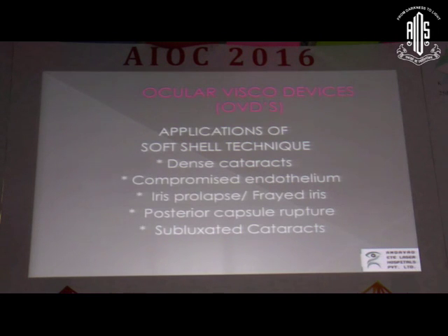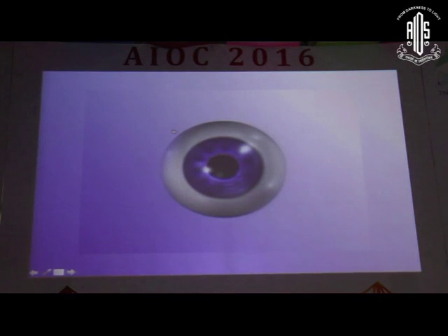Okay, something very important Dr. Shiv Ashrinov gave all of us was the soft shell technique, which is usually used in dense cataracts, in compromised endotheliums, iris prolapse, posterior capsule rupture, and subluxated cataracts. And I'll show you a couple of animations to support them.